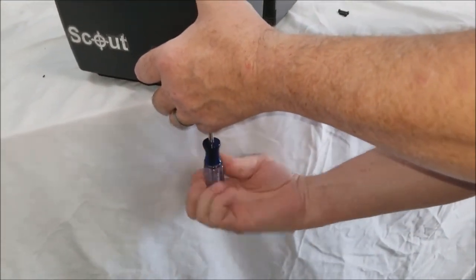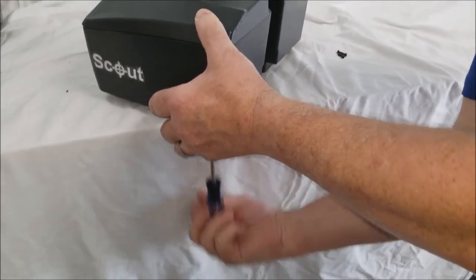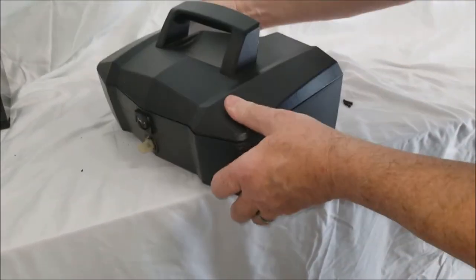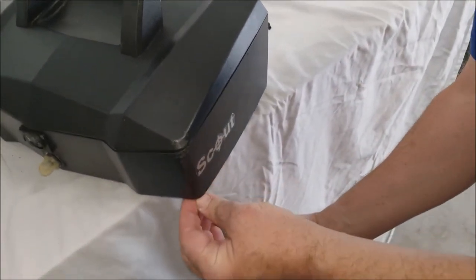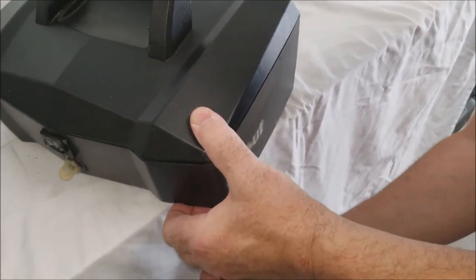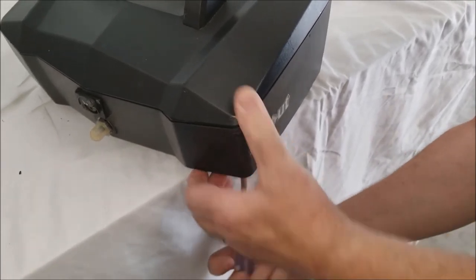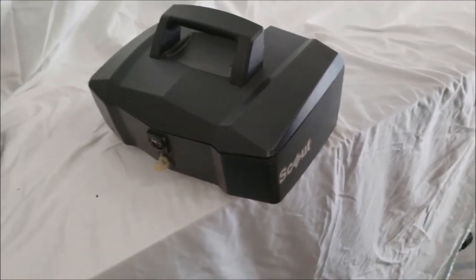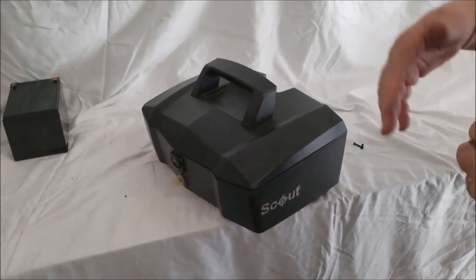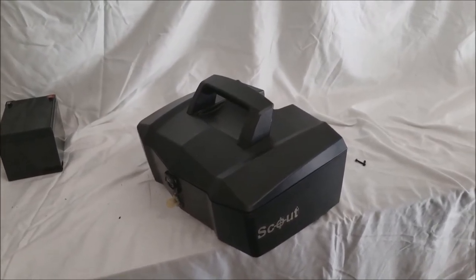put that screw in, turn it again, take another screw, and do that with all 4 screws. And then, when we're all done, we can turn the case over and put the remaining 4 screws in.